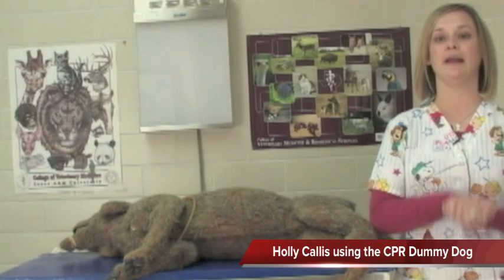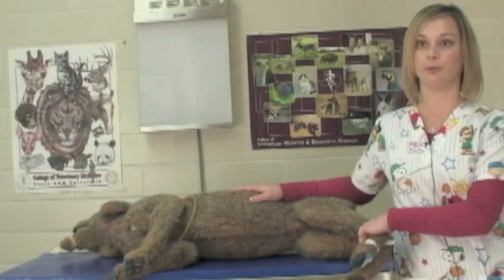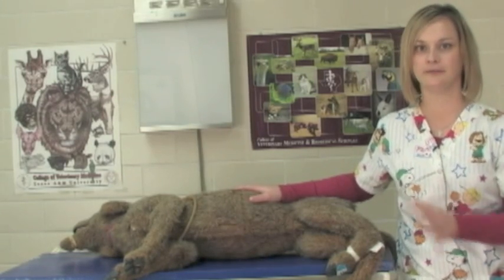Restraint is a big thing in radiology. We do most of our exams on our small animal patients on tables. So it's extremely important to restrain the animals well so they don't jump off the tables, get themselves hurt, anything like that.